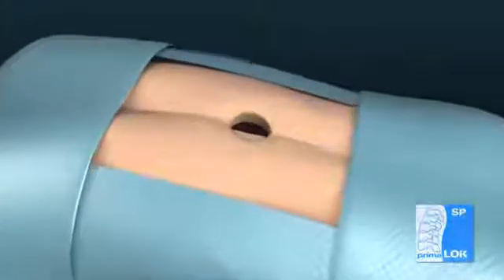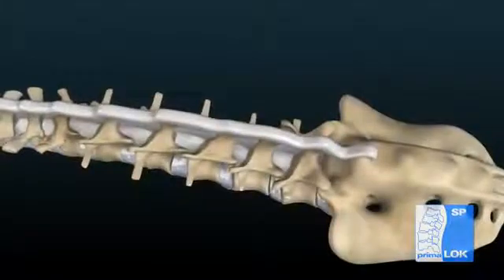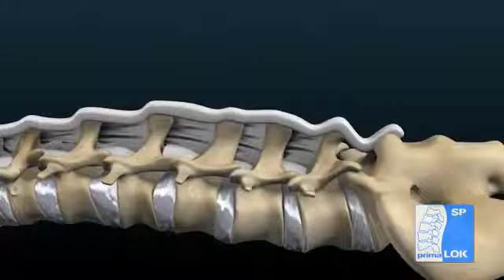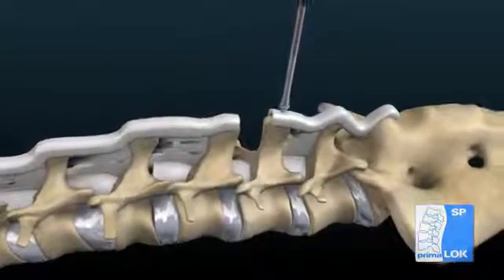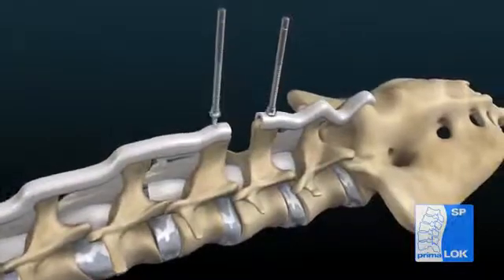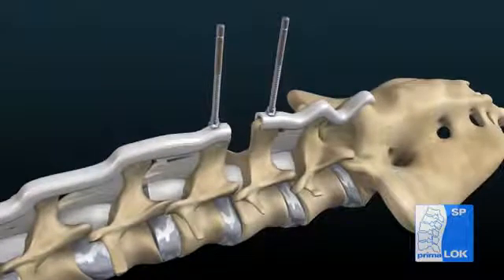Remove the supraspinous and interspinous ligaments to allow for proper sizing and placement of the PrimaLoc SP. Place distractor pins in the spinous processes and distract the space using the lumbar retractor and extension arms.